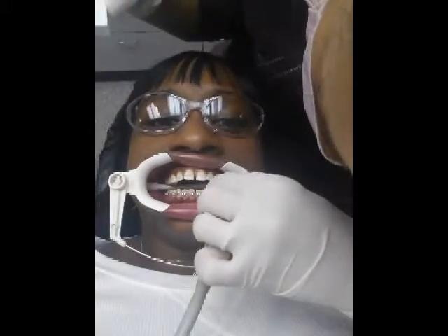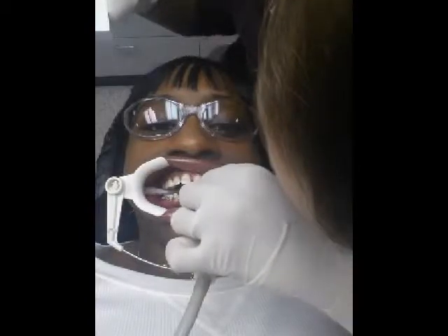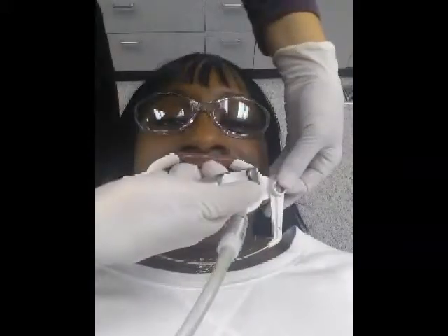And with the metal brackets, you can see how she just easily placed those on each tooth. Now with the clear brackets, they have a color code. They're coded specifically for the tooth that they go on each side. Like you'll see the two front teeth, both of them are blue, and then the teeth on each side of those front teeth, I think both of those are maybe green or something like that, but they're color coded.